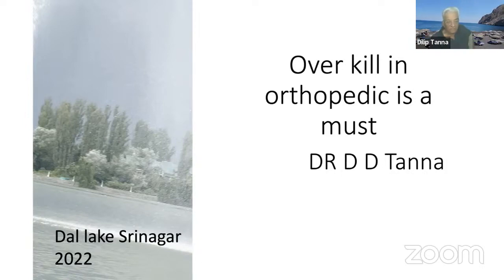If you don't have a flexible reamer, then even the tibia will be difficult to ream unless you take it like that. It is impossible. And for the femur also, half the time it's a 12 mm nail, and 40% it's 11 and 60% 12. But as you rightly said, you have to ream 1.5 plus. So unless you have a flexible reamer, you can't do it.